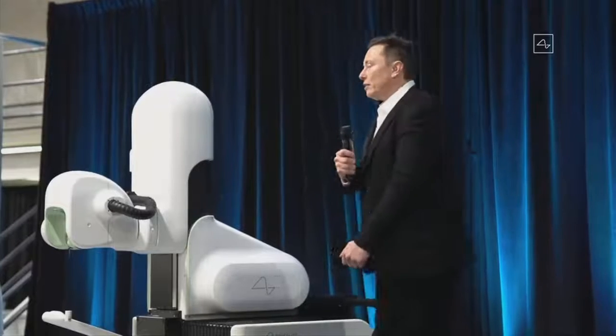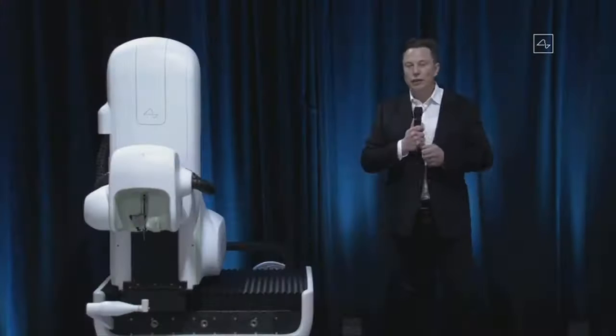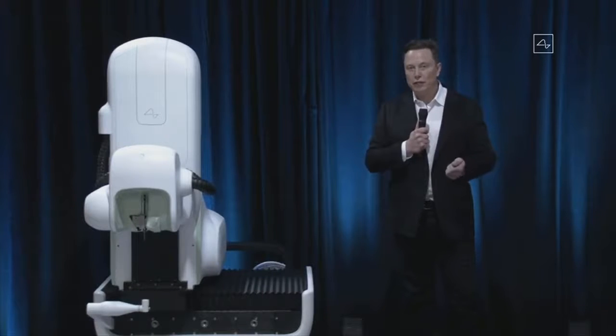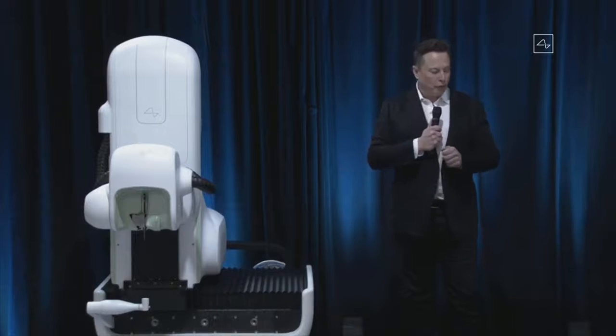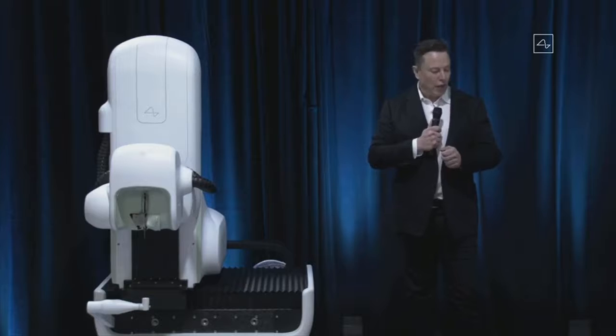In terms of getting a Link, you need to have a great device, and you also need to have a great robot that puts in the electrodes and does the surgery. You want the surgery to be as automated as possible, and the only way you can achieve the level of precision that's needed is with an advanced robot. The installation of a Link is done in under an hour. You can basically go in the morning and leave the hospital in the afternoon, and it can be done without general anesthesia.